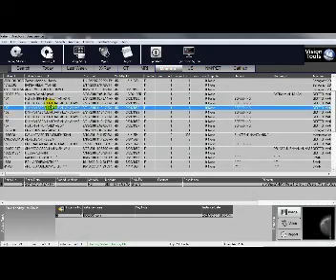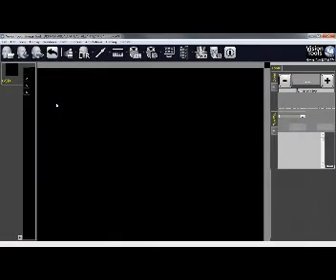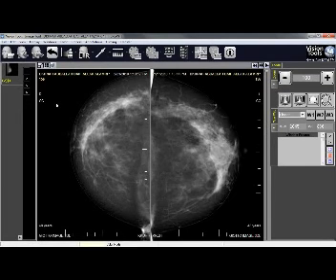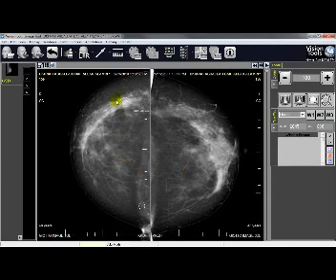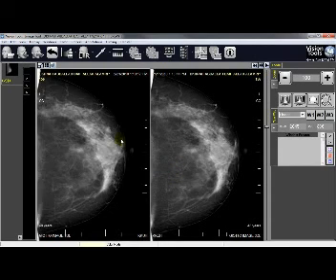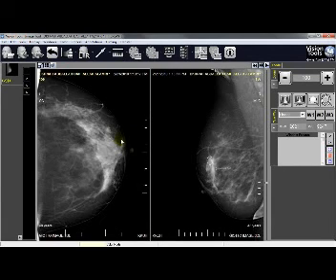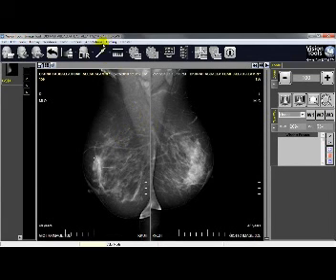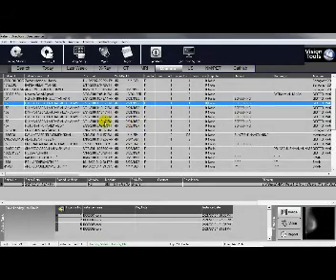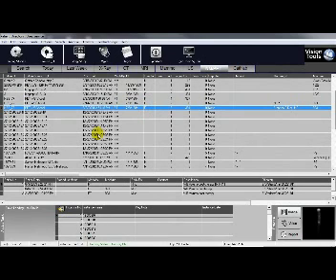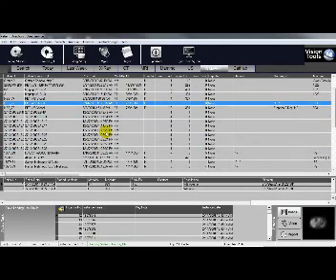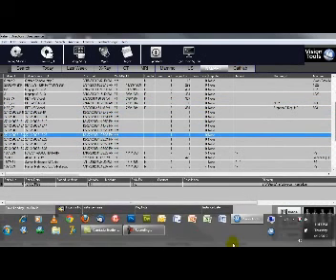For mammography, just double-click and the mammography hanging protocol is applied automatically. If the study has a CAD, it can be shown on the study itself. This release has demonstrated features for CT, MRI, mammography, X-rays, and nuclear medicine. We hope you enjoy this new release and the new experience — thanks!